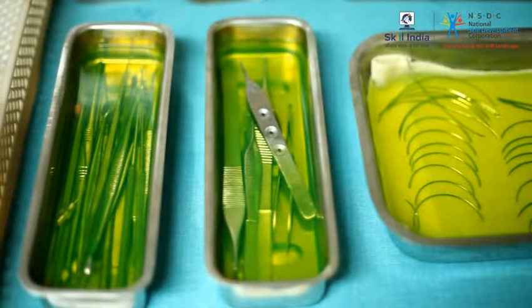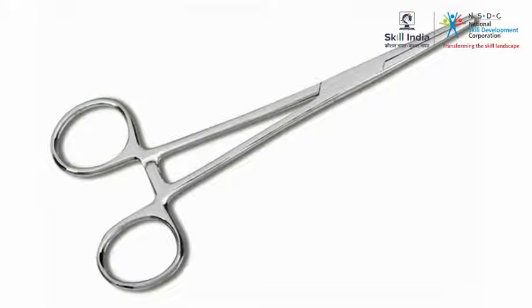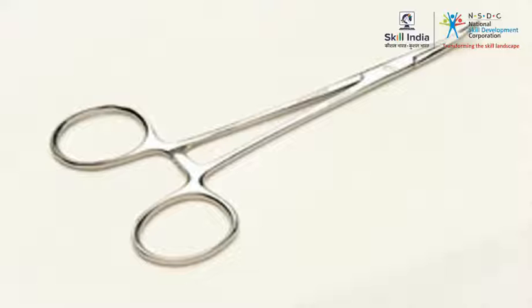Common surgical equipment. The instruments that are used in the operating rooms must be free of infection. So, it is important for you to identify the equipment that is used in the operative procedures. Forceps is a hinged instrument resembling either a small pair of scissors or a pair of tweezers. Forceps are used for holding tissue. Hemostat is a type of forceps that is used for controlling the bleeding during a surgery.